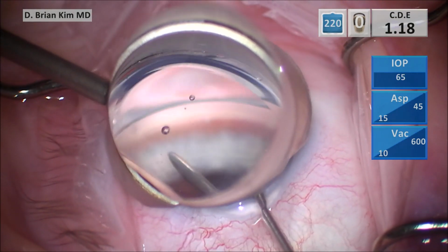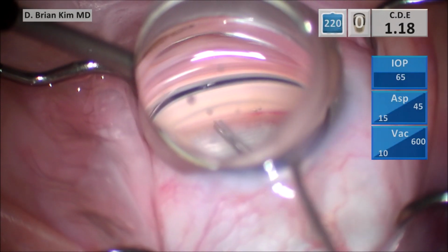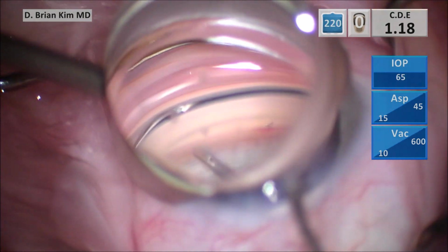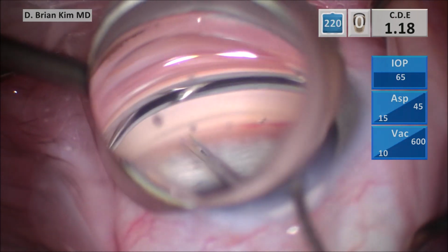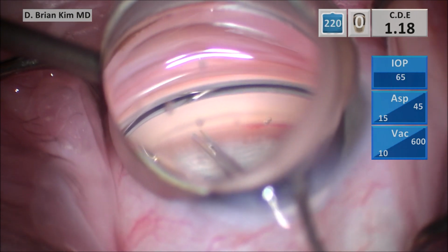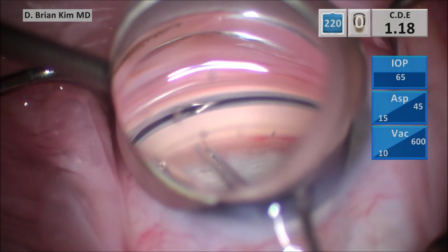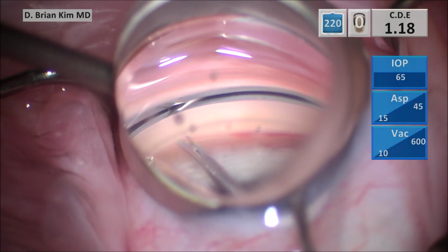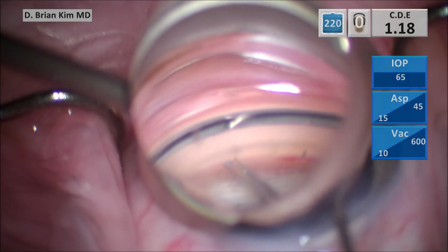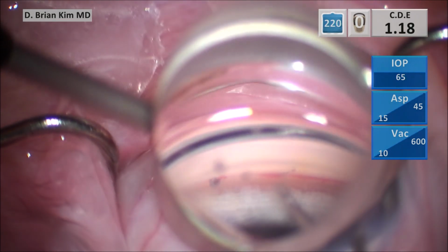So pearl number one is obvious. You want to place the first stent as far to the left as possible without causing any corneal stria by making sure you have a perpendicular approach to the trabecular meshwork and you're able to have a very good placement of the first stent. I went ahead and retracted the sleeve, and now you can see the window very nicely with the trocar in the middle. I'm going to dimple, making sure that the trocar is central and not abutting the walls of the shaft, and then fire, and then very carefully withdraw straight back. By doing that, it minimizes the chances of dislodging the device.